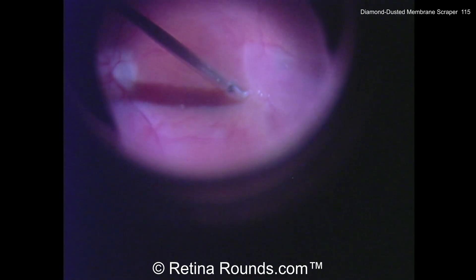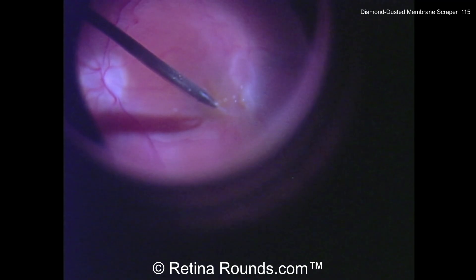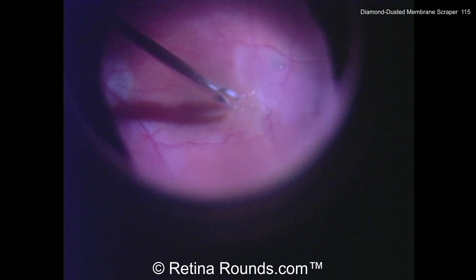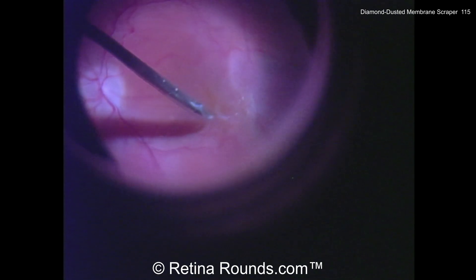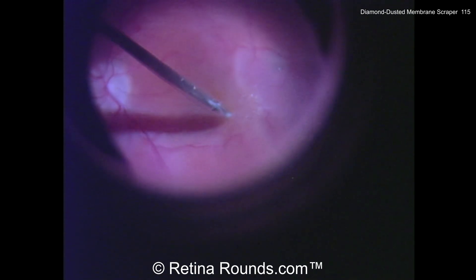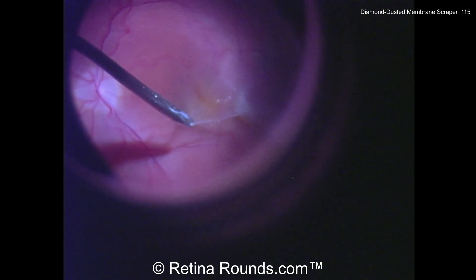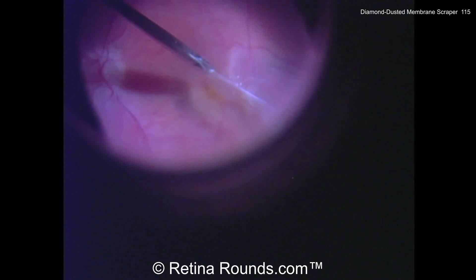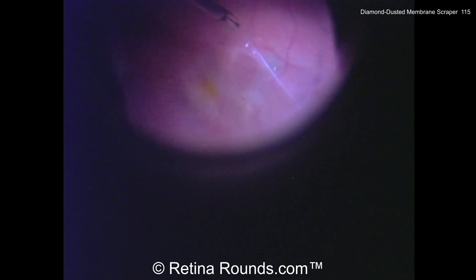Now, once that edge of the ERM has been elevated with the Tano scraper, you can see here using forceps the membrane is being gently elevated from the retinal surface, first in an anteroposterior motion, just to create some more separation between the epiretinal membrane and the underlying retina. And now you can see that the ERM has released from the underlying retina and can be elevated and peeled back away from the central macula.